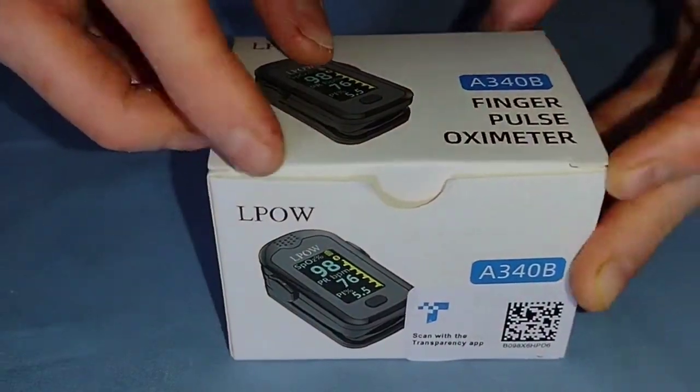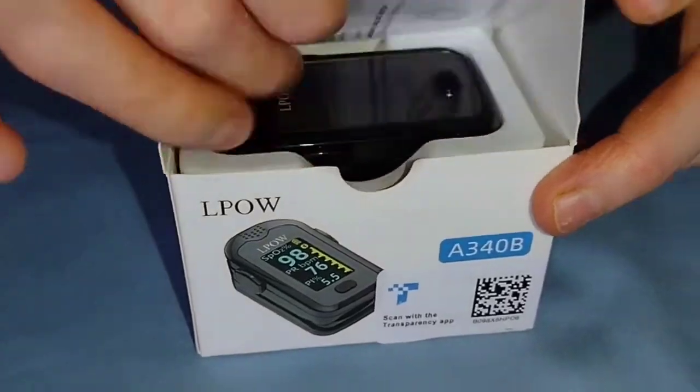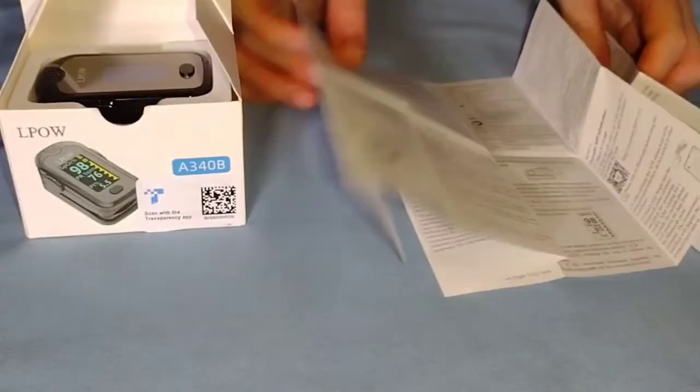This is the LPOW Bluetooth pulse oximeter fingertip OLED display blood oxygen saturation monitor and pulse rate. Opening it up, the first thing inside is very detailed instructions with information about each of the measurements it takes, how to charge it, troubleshooting, and also how to use the app that is associated with it.